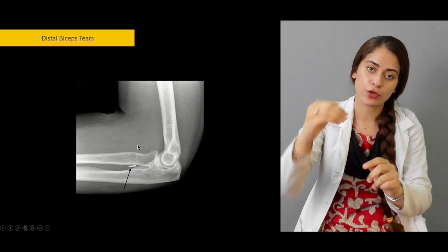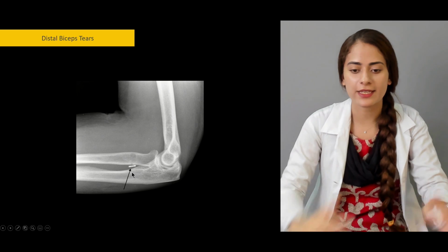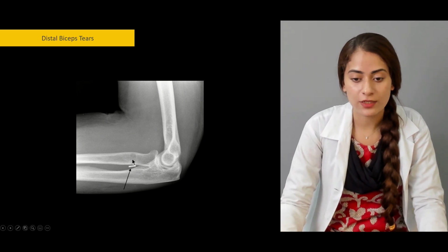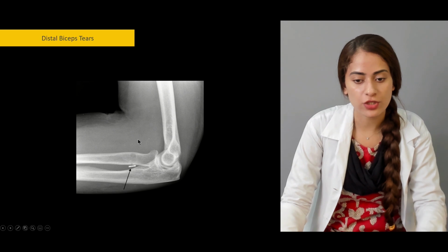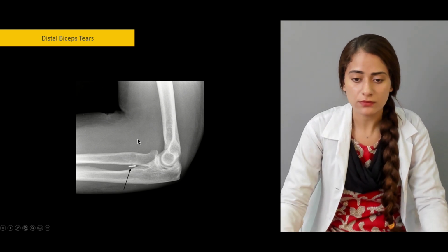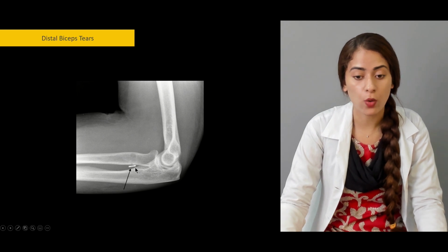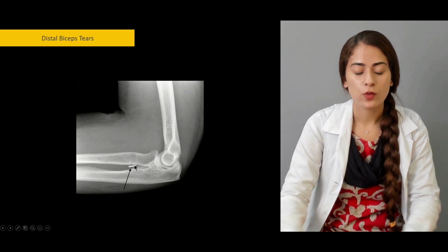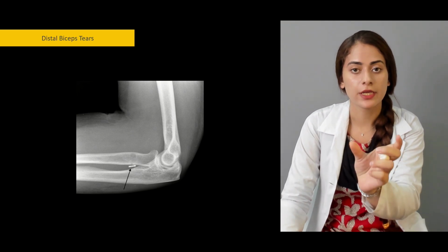So the distal aspect is attached to this endo button, which can pass through this hole if it is in vertical orientation, right? Let's just take it into imagination. So this is in vertical position, and we attach this. Let's suppose this is the ruptured tendon here. We attach it to this endo button, and then in a vertical orientation, we insert it in this hole that we have drilled.